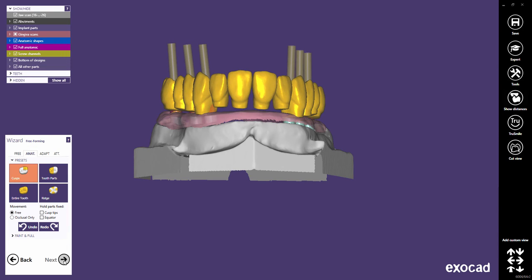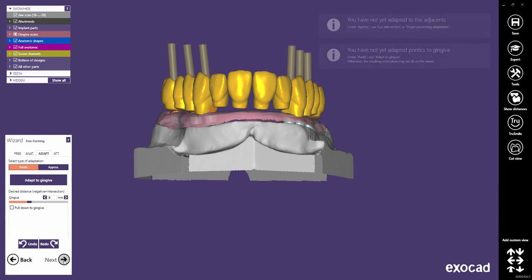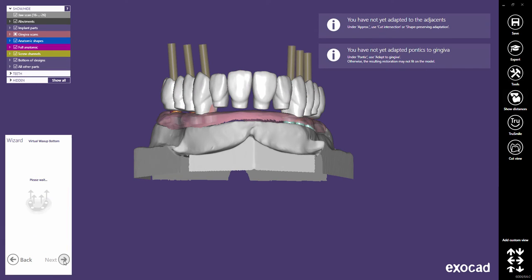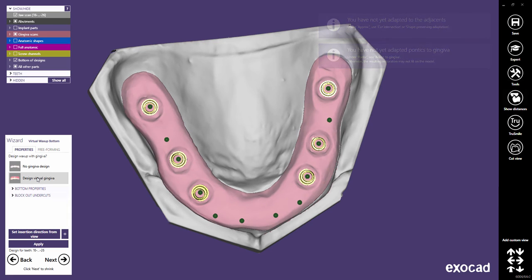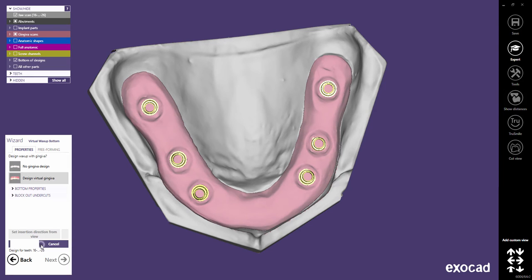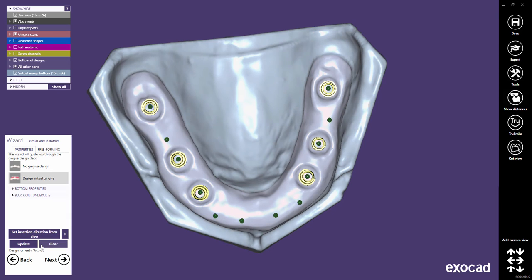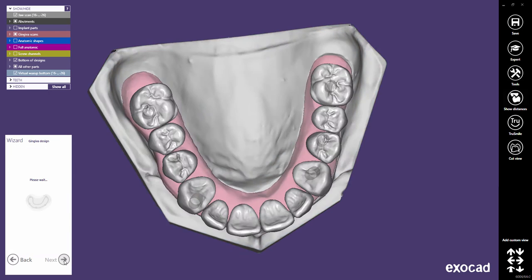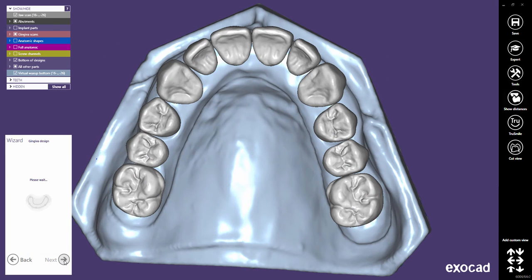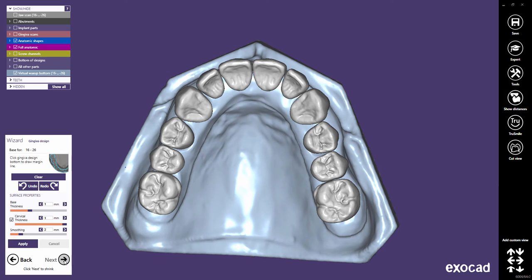Let's skip the free forming. Select Design Virtual Gingiva in the Virtual Wax-Up Bottom dialog. Click Apply to start blocking out the Virtual Gingiva's bottom. A separate video tutorial will explain the available settings in this dialog. Proceed to the Gingiva Design step to draw the margin of the gingiva.